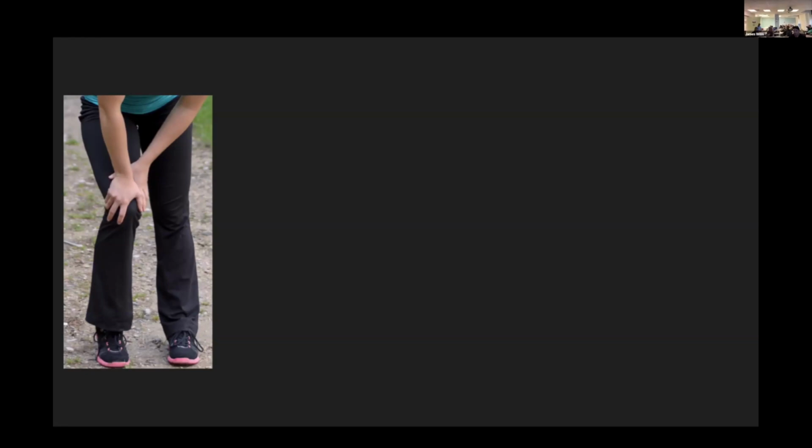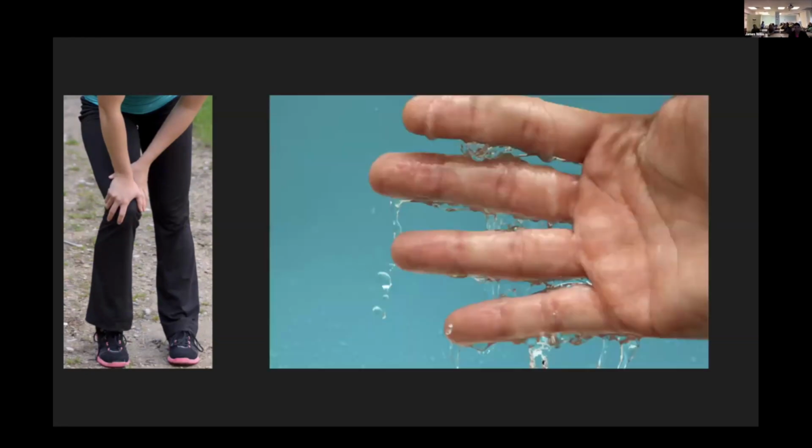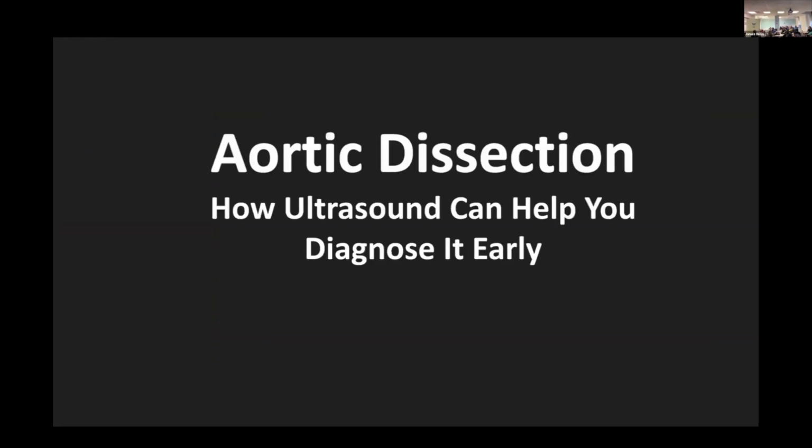Your knees are weak. Your palms are sweaty, all right? Because you are concerned this patient may have an aortic dissection and a hemorrhagic pericardial effusion, okay? And so today our lecture is going to be on how ultrasound can help us diagnose this earlier.